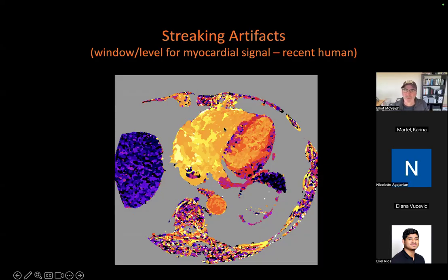I just know this from this data set. And it's later in the left ventricle, say about 32 seconds, and then when we look out in the myocardium, you can see there's a highly variable temporal point at which the signal for that voxel reaches its maximum.